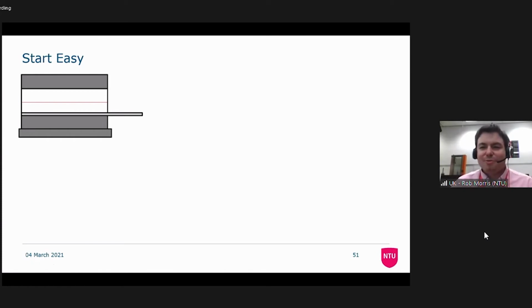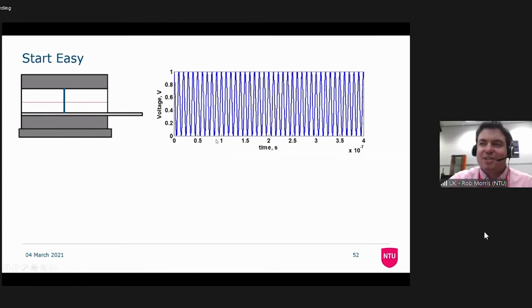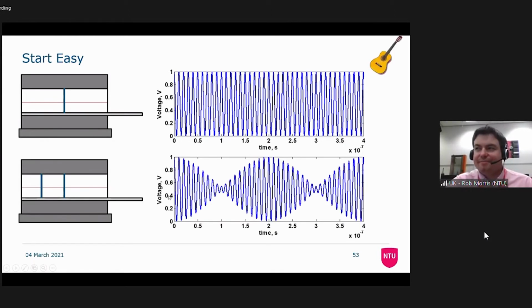and my discs of water inside. And to start off with, we're just going to have our single disc, which is at B0. And lo and behold, this is ignoring relaxation, we will just have a single frequency of output. And this single frequency of output here is gamma B0. Nothing exciting so far. However, when we put in our second disc, things start to get strange.